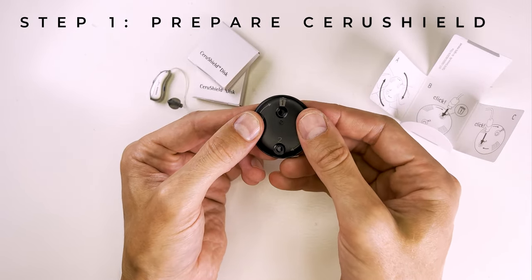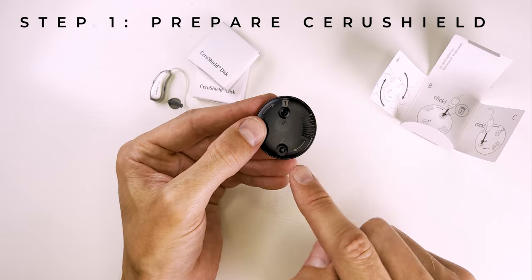As it turns, you should hear a clicking sound, and you'll notice a replacement Serashield appear in window number two.